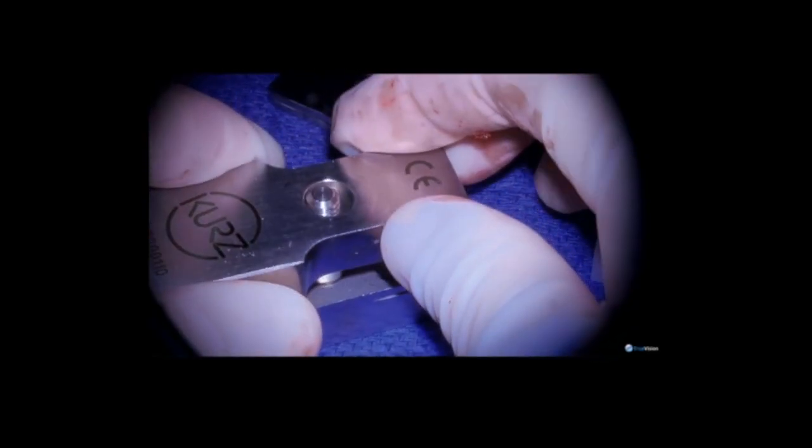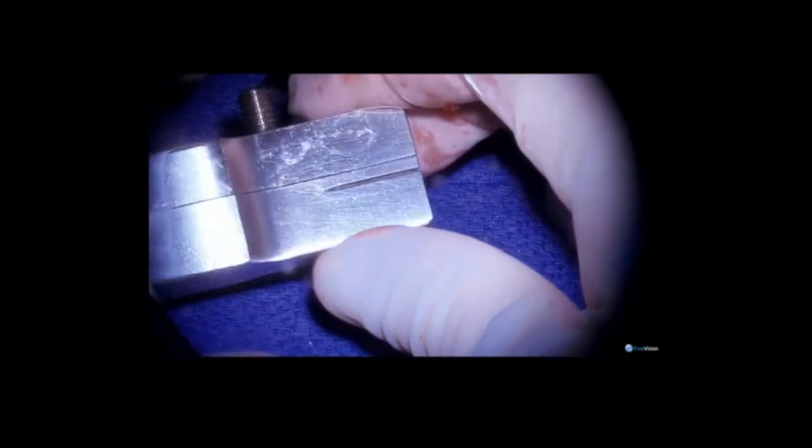I place a 0.3 millimeter shim in a Kurtz-style cartilage cutter and then slice the cartilage in half under direct visualization with the microscope.